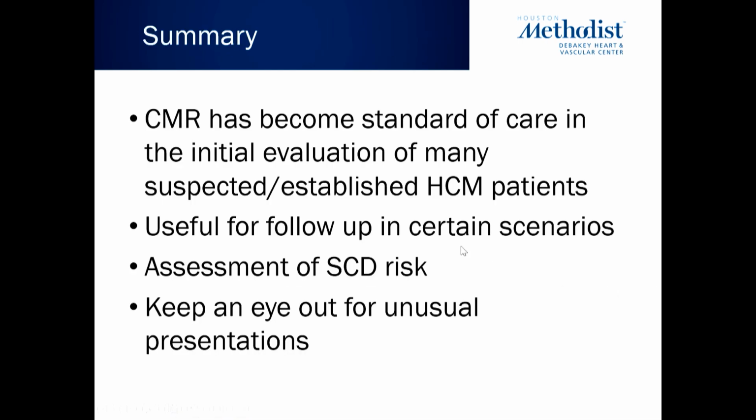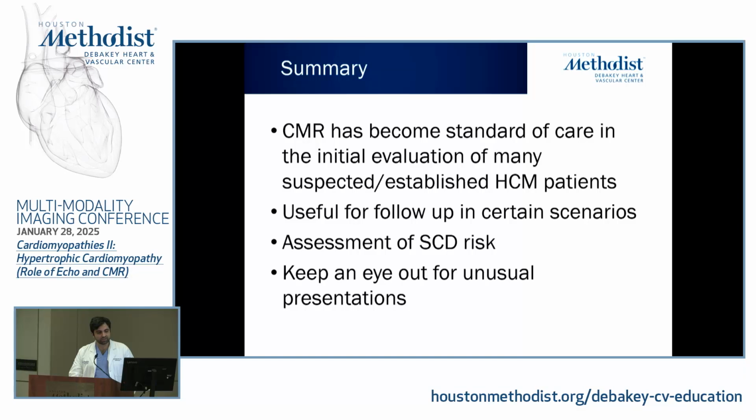All right, so it's become near standard of care nowadays to get MRI in people with suspected and established HCM, particularly for scenarios when the diagnosis is uncertain, follow-up in younger patients, assessing evolution in LGE, and then obviously further enhancing the SCD risk stratification, and then keep an eye out for these unusual presentations.